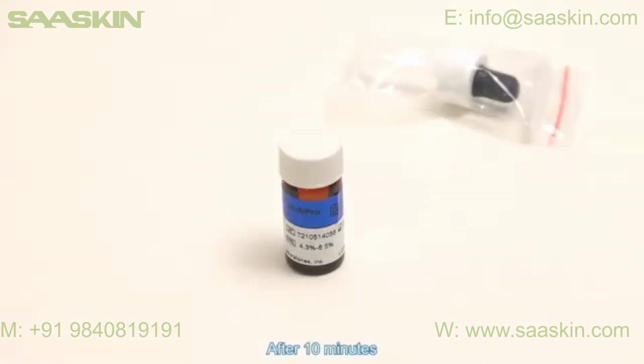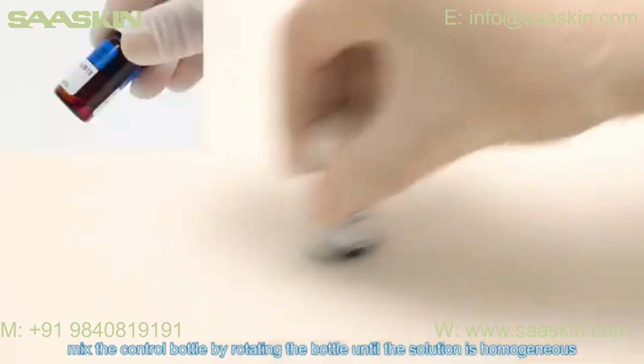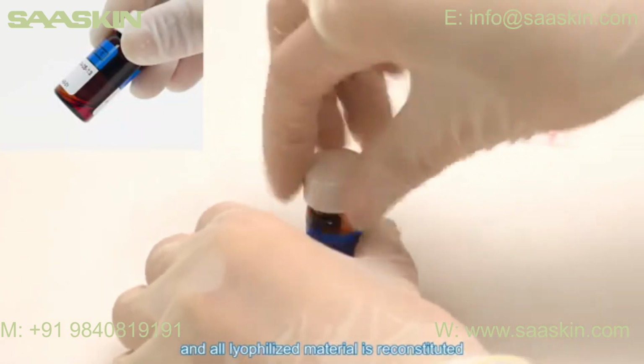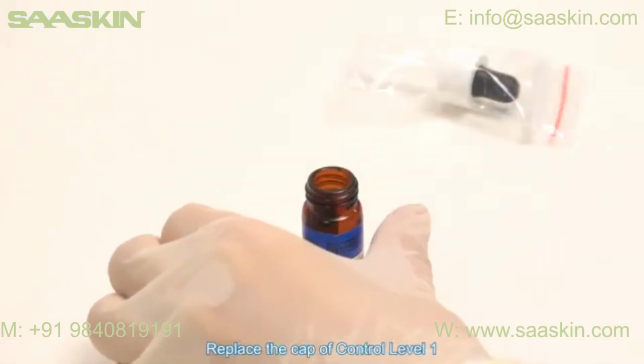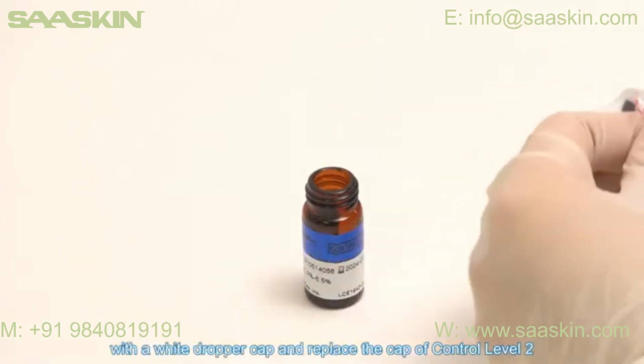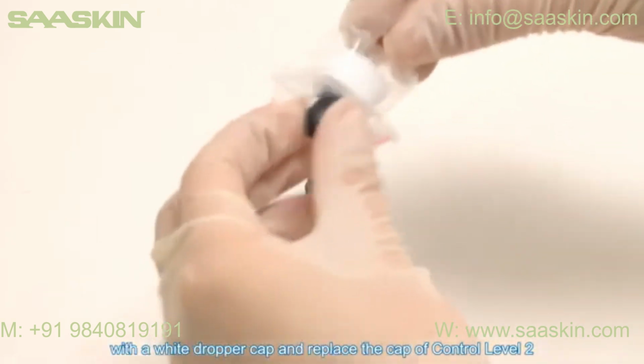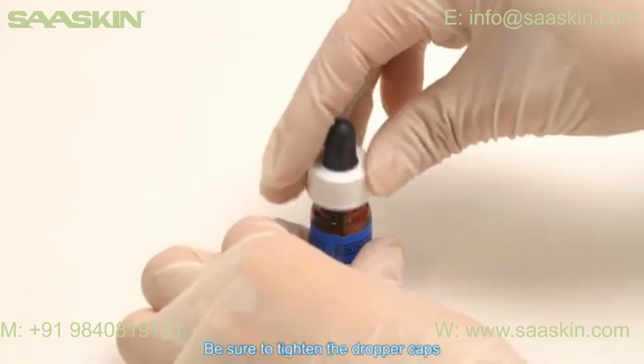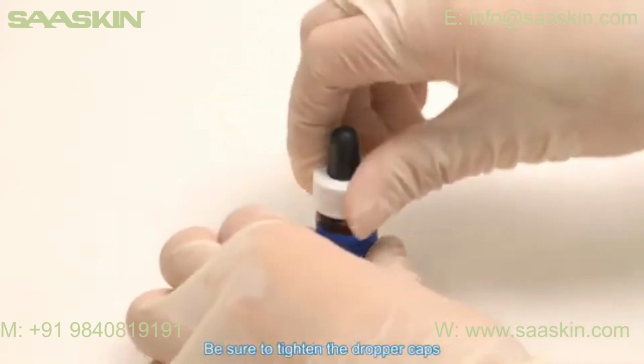After 10 minutes, mix the control bottle by rotating the bottle until the solution is homogeneous and all lyophilized material is reconstituted. Replace the cap of control level 1 with a white dropper cap and replace the cap of control level 2 with a black dropper cap. Be sure to tighten the dropper caps.